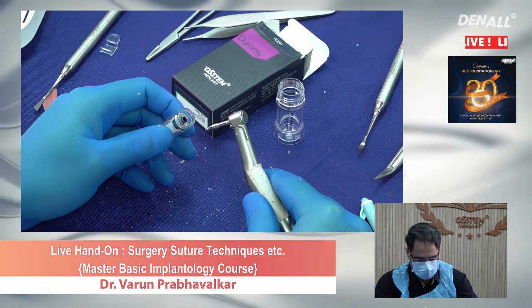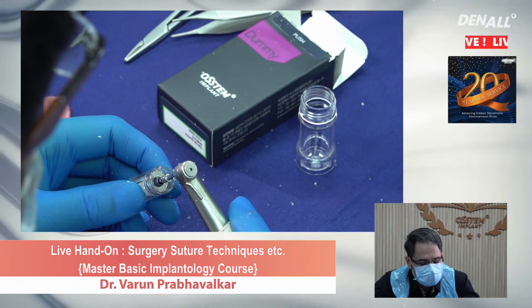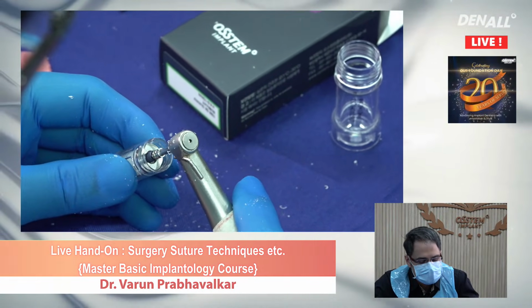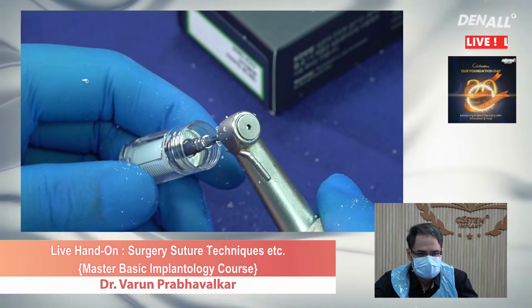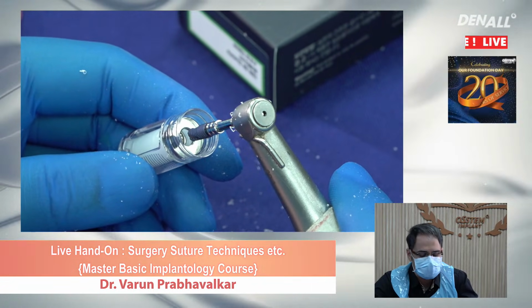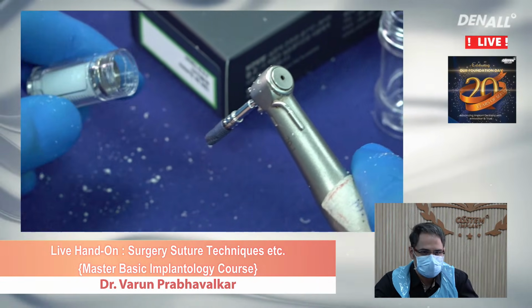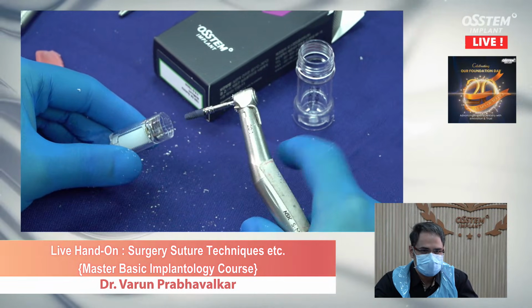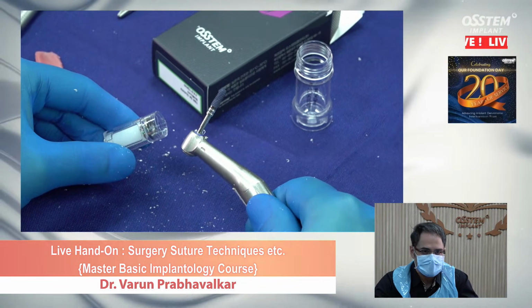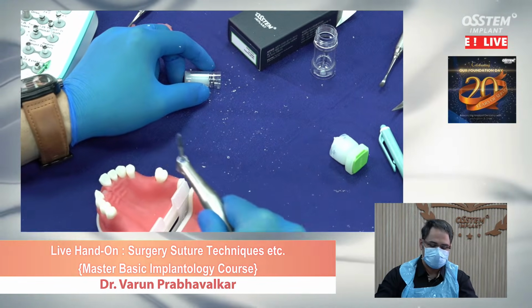All I'm going to do now is grab this implant like this. You hear that sound? That sound ensures us of complete engagement, the implant is not going to fall. Always carry the implant from the packaging to the patient's mouth this way. Always, so that it does not fall. You carry it to the patient's mouth.